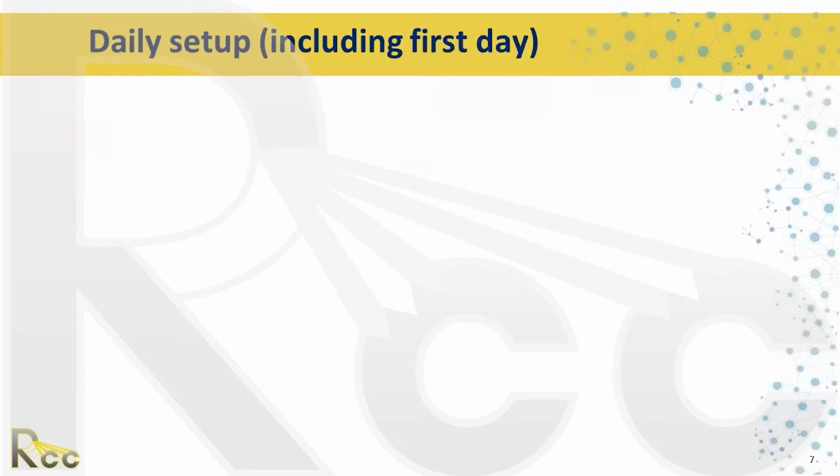So I always start when we bring a patient in the room by checking and making sure that we have the correct patient. And especially on the first day, you want to just reconfirm the correct site. Like, this is you and this is what we're treating. I'll usually even tell the patient, every day we're going to check and make sure that we have your information up and remind them that that's the most important part, is to have the correct patient.